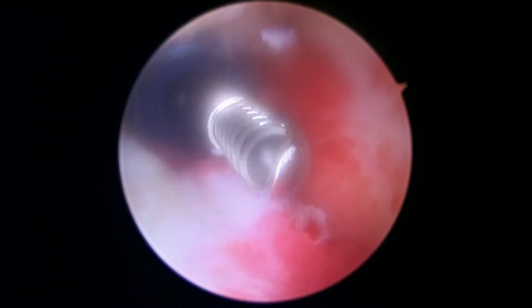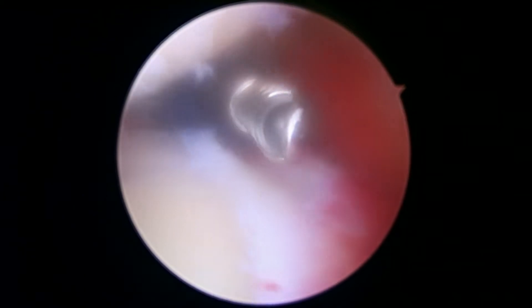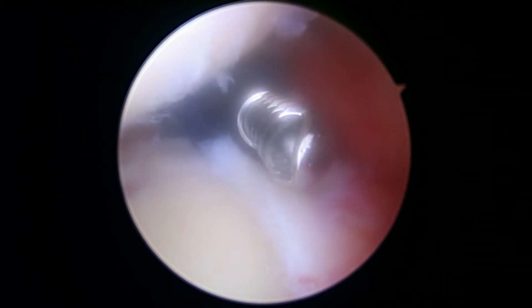Hit the pressure up about 15 millimeters. Go to about 60, even 65.